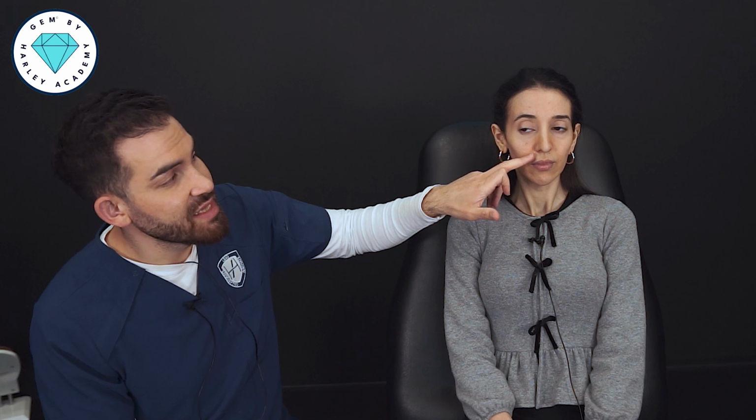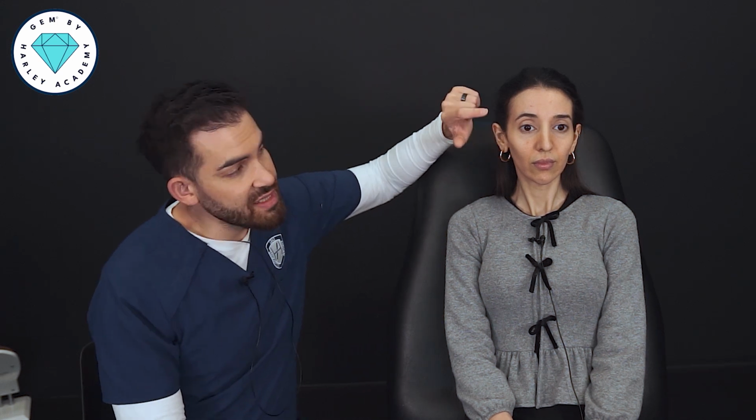I'm quite happy with the curvature to the forehead. We do have some volume loss in the temples, and if we replace volume here, we're going to start to see an improvement to the periorbital area. It's going to also improve the midface. I see a very classical area of volume loss in the midface. This flattening in the anterior cheek is where we lose some of the deep support, the deep medial cheek fat, and we start to get some flattening. And I think that will be a really nice opportunity to create some youthful volume in the anterior cheek.